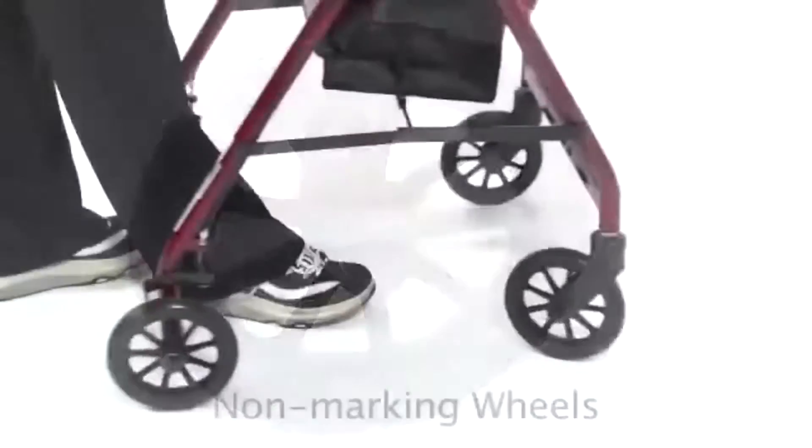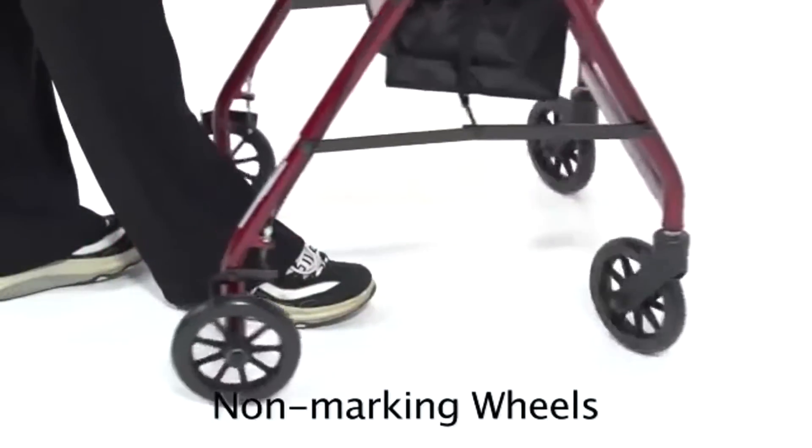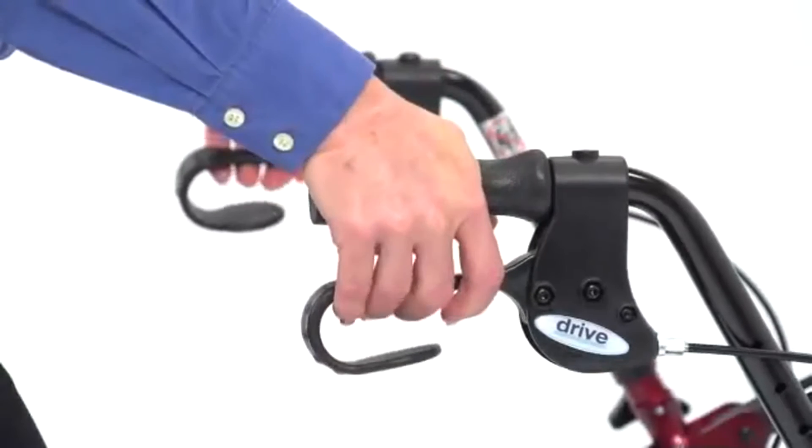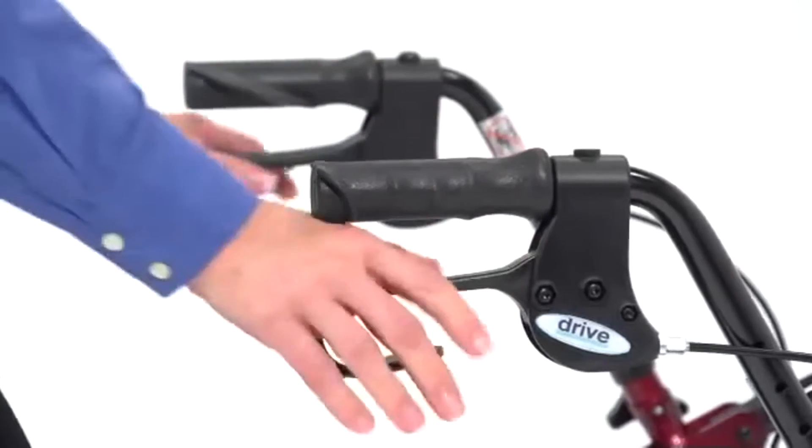When it comes to safety, 6-inch wheels and soft grip tires add stability on various indoor and outdoor surfaces. In addition, these loop locks operate like a bicycle handbrake to lock the wheel by simply pushing down on the handle.